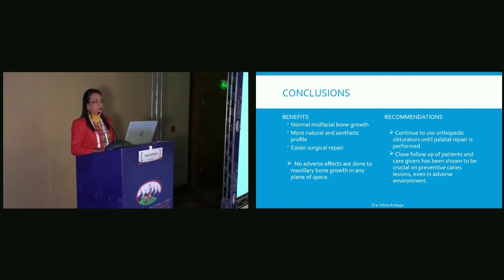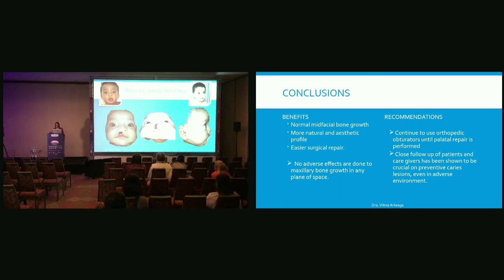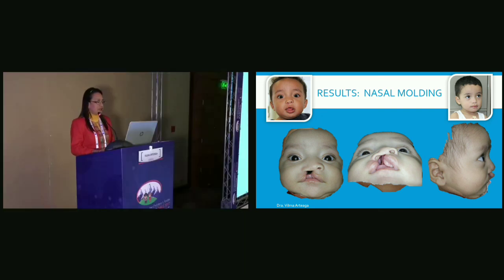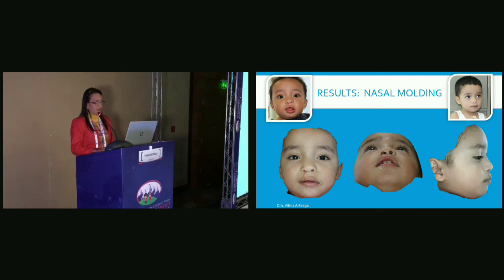This is the patient 1 month after the surgery and 1 year after the surgery. The pictures underneath are when he first came to the clinic, and this is the result of the patient. But I would like you to see the basal picture where you see the hypoplastic maxilla on the cleft side. At the end, 1 year after, the patient has normal mid-facial growth, and the profile is even a little bit protrusive.